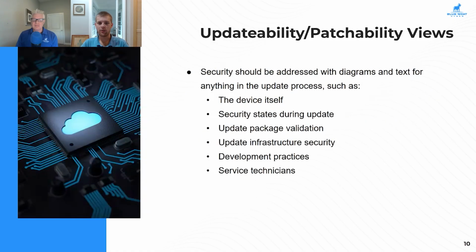and what some of the examples are with updatability and patchability. So I know we talked a little bit about this process, but some of the things that we want to consider here would be diagrams and associated descriptions for everything in that process. The device itself, security states during update. We're going to talk about our security use case views in a second here, but that's where we're talking about different operational states. So what is the device doing while it's receiving updates?